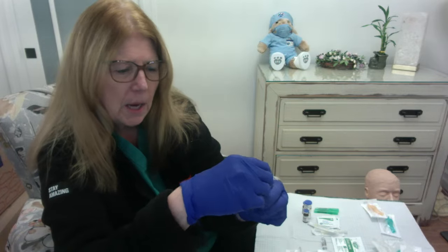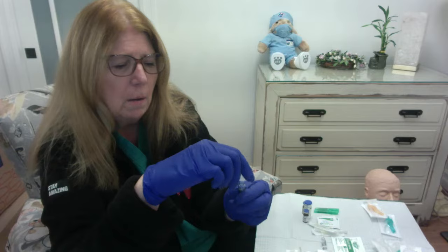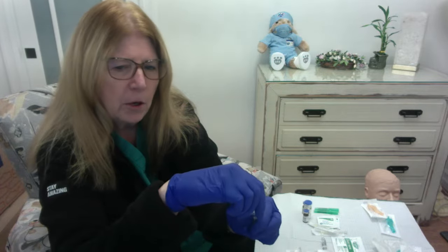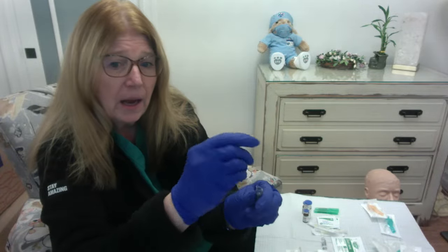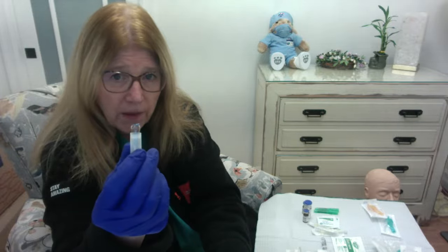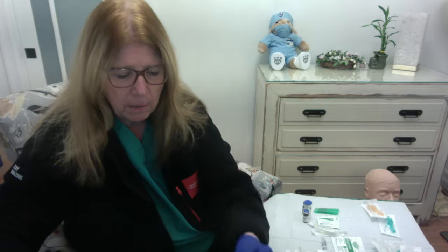When you're breaking an ampule, you always want to break it away from you, never towards your face, right? Because this is glass, okay? So I'm going to push this down a little bit, and I'm going to use my thumb to push forward, right, and break the neck of that ampule. So here's my top portion of the ampule, which would have to go in the sharps container. And now I have my ampule with the neck broken off.